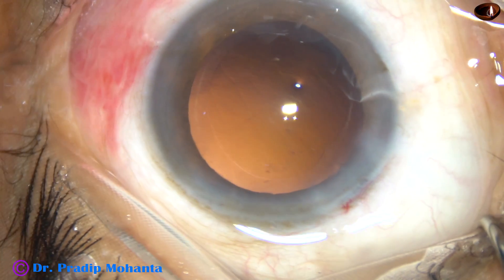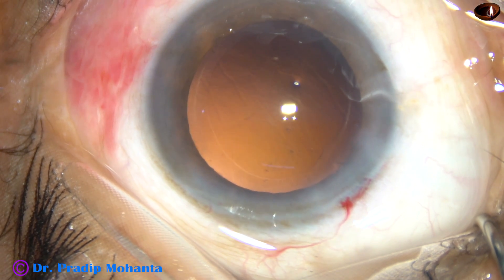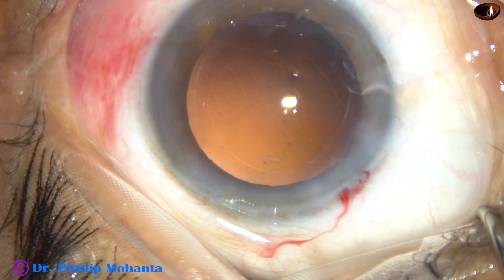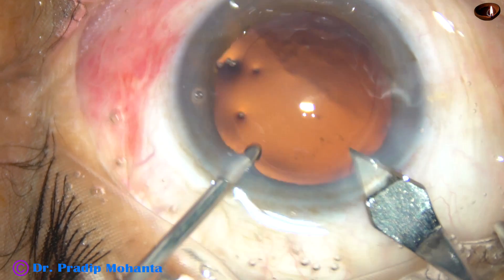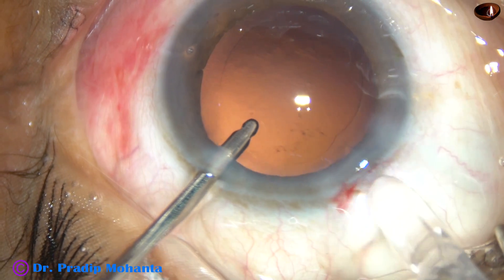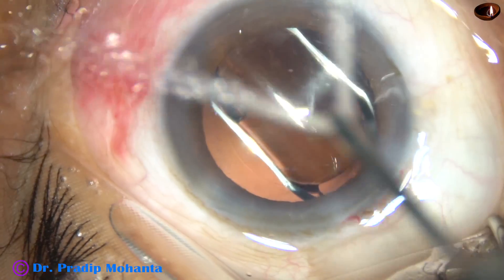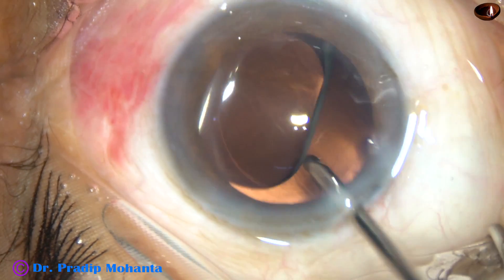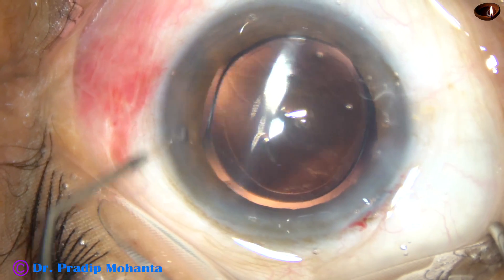In this case, I am going to use a B cartridge, so I am going to enlarge the main incision by about 0.2 mm — from the initial 2.8 mm — using the keratome with irrigation. The B cartridge is loaded with a hydrophobic acrylic intraocular lens — this is the Tecnis 1 from AMO. It is a beautiful lens that I like very much.